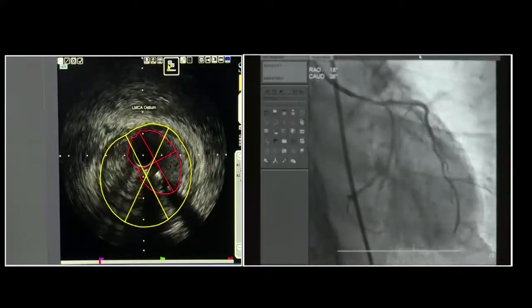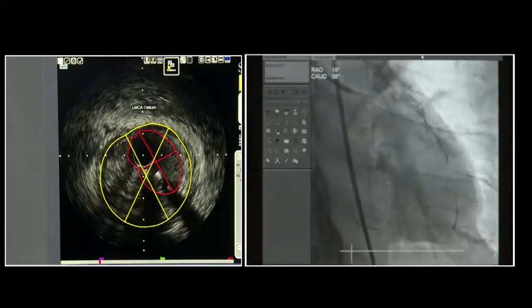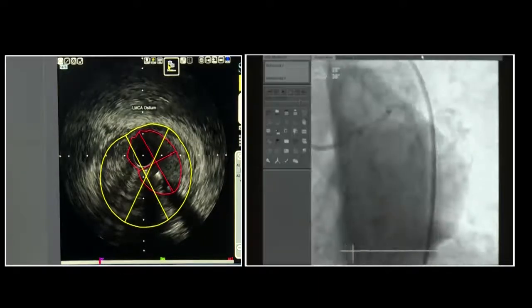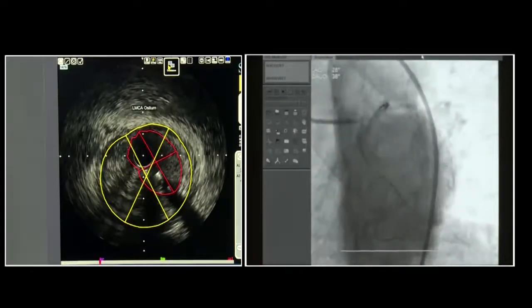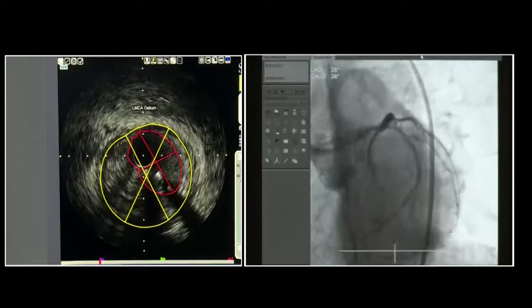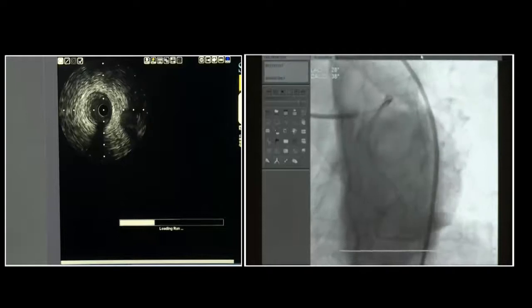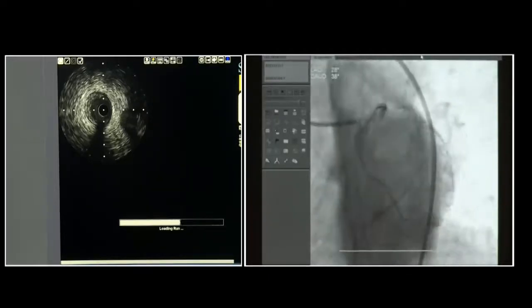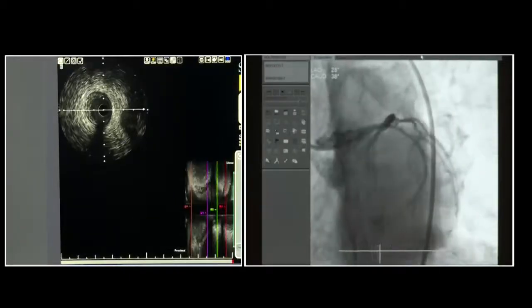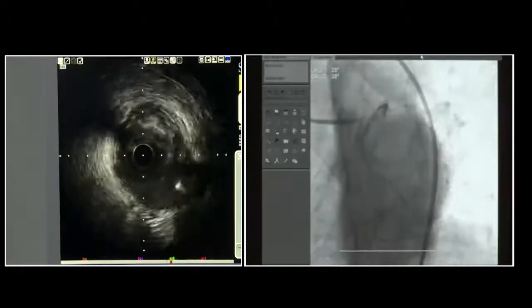And if we want to have a two-stent technique, what kind of technique will the house like? Next, please. We are trying to separate out the ostium of the circumflex. Next. So what technique will you like? Because if you are able to really see this: DK crush, culotte, or T stenting, meaning TAP. Some people said culotte, some mini crush or DK crush, just similar. Most of them are favoring mini crush or DK crush, and culotte.